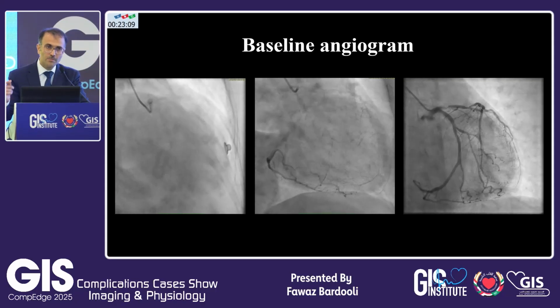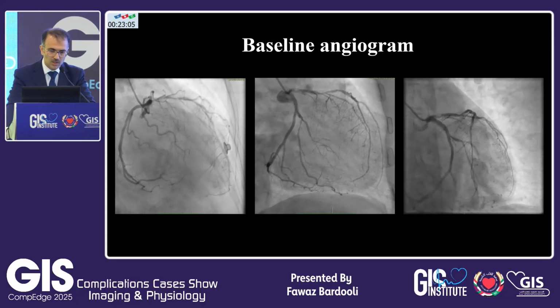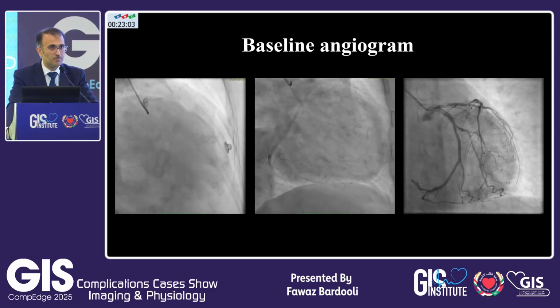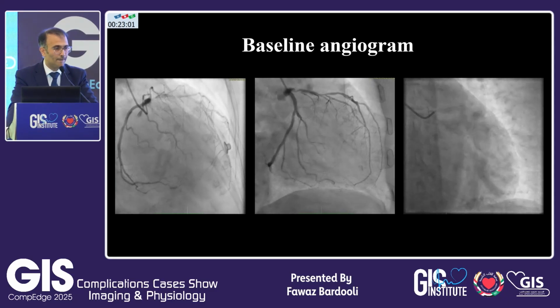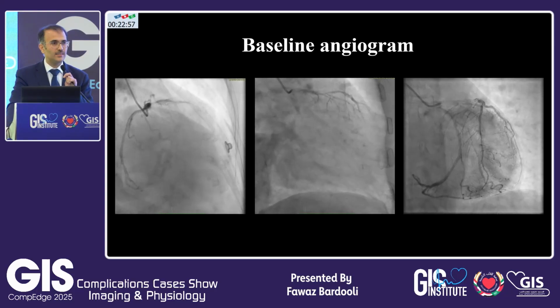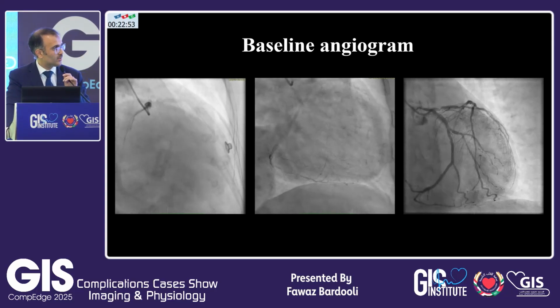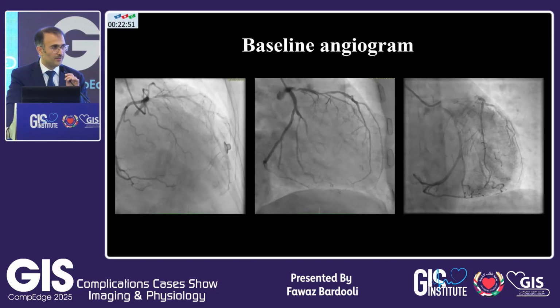So if one person wants to stand, or the panelist, to describe to me where exactly he's going to treat this patient. Any candidate? You have an anterior hypokinesia, EF 35, non-STEMI. Which is the culprit, and is there anything you want to highlight?